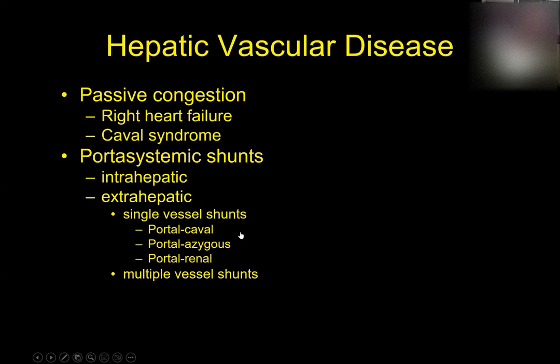Okay. Sonographically, they're not hard to find because you look for usually a dilated kind of tortuous vessel that directly connects one of the intrahepatic portal veins to the caudal vena cava. So you look for a direct connection with ultrasound, usually an abnormal little tortuous vessel that connects a portal vein to the cava. And again, almost always they will be congenital. The animal's born with it, and they're almost always large breed dogs.